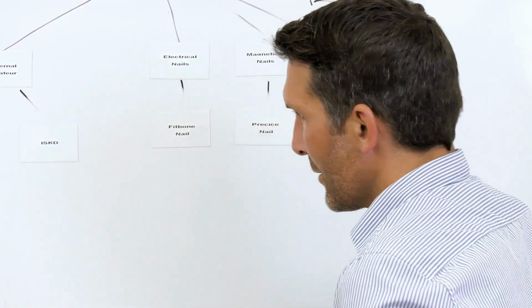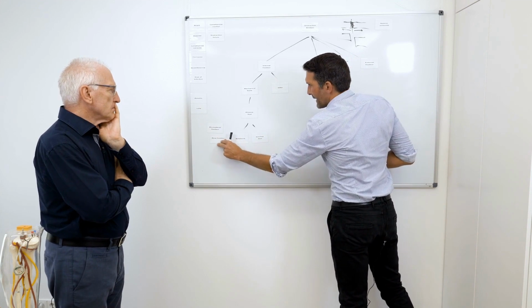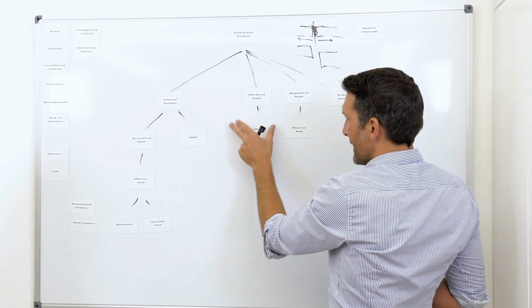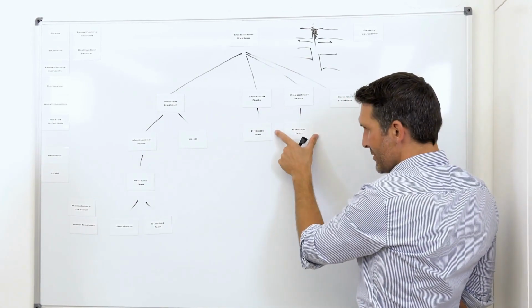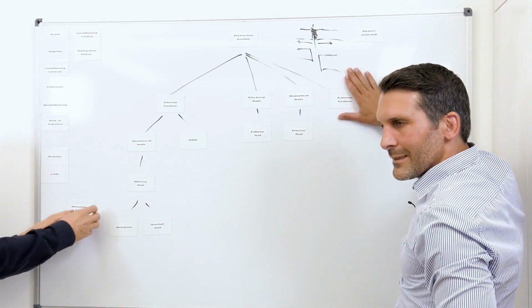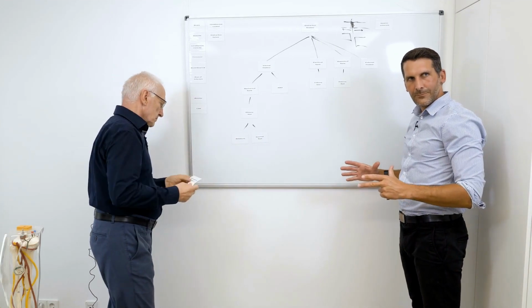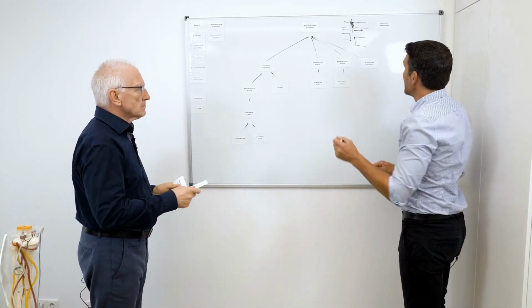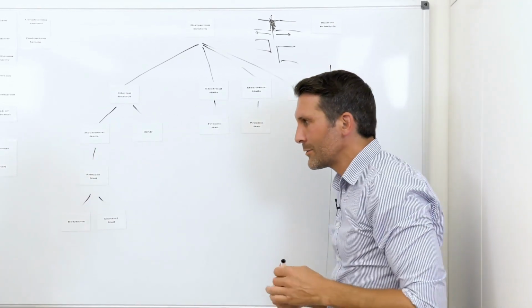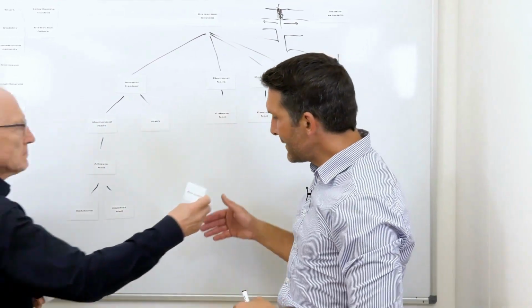So, now we've talked about the nails. A rough overview. We have purely mechanical nails. We have electrical nails and we have magnetic nails. Then we have the extension mechanisms, which are derived from an external, that is, outer system. And now we have a special group. We have the combination of an external and an internal system.